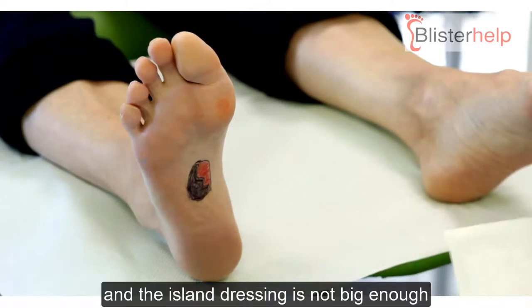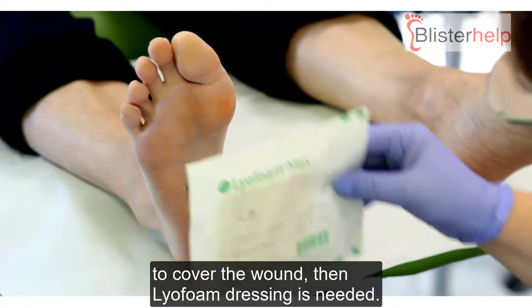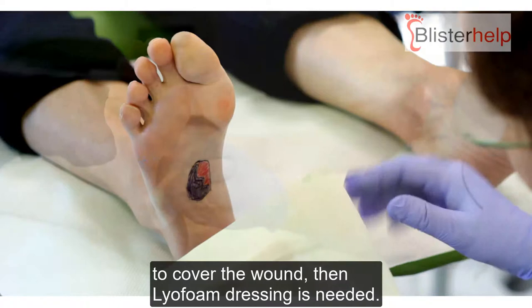If the blister is large and the island dressings are not big enough to cover the wound, then Lyofoam dressing is needed.